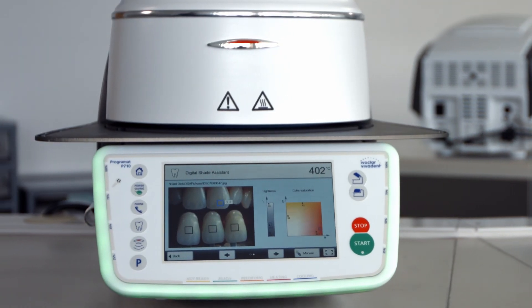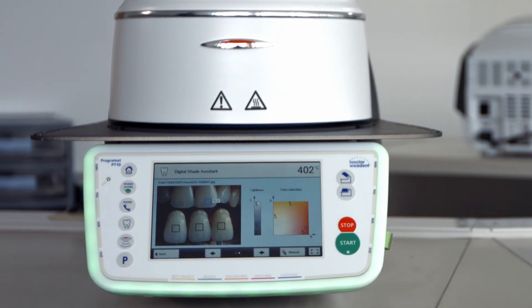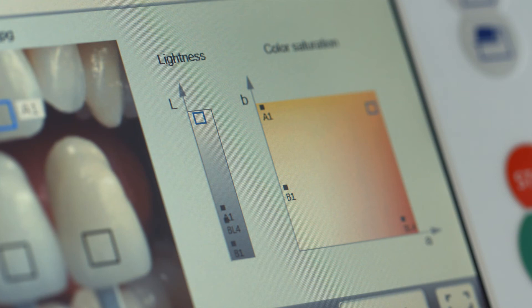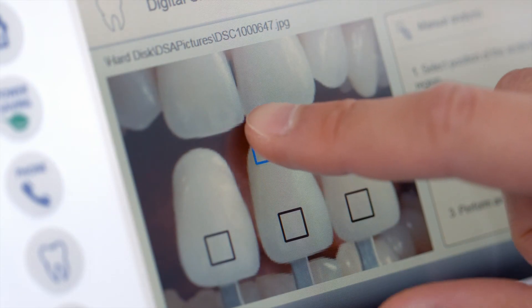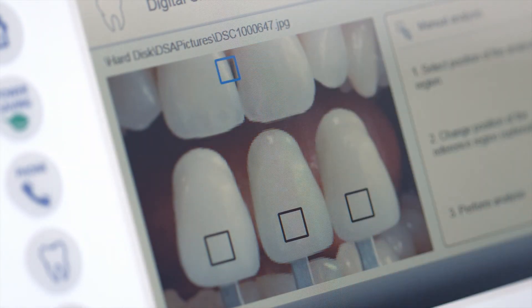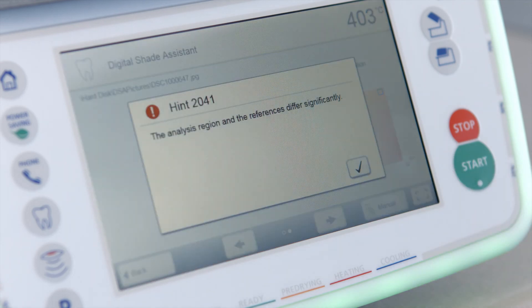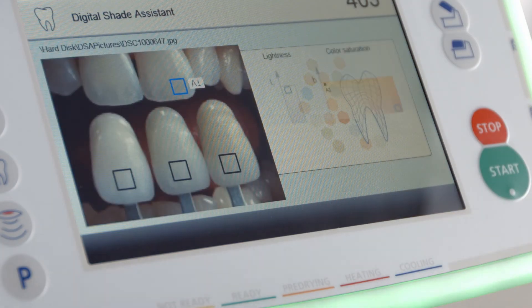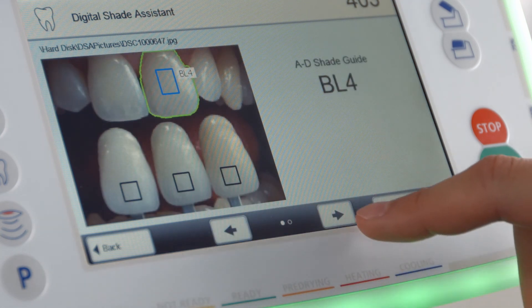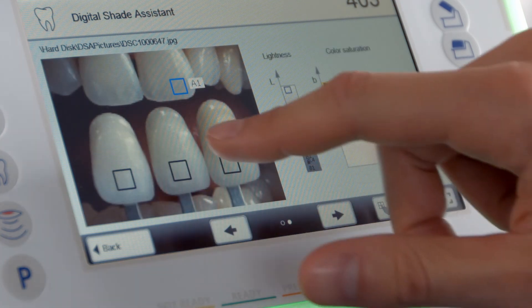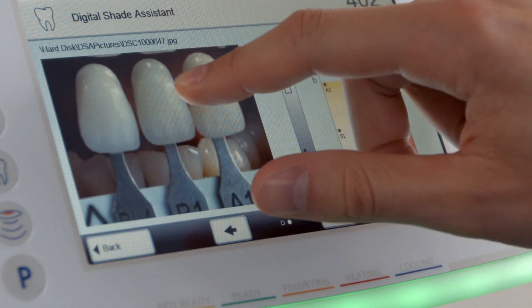The right panel of the display shows two diagrams. The diagram on the left shows the brightness of the three reference teeth and the tooth being analyzed. The diagram on the right shows the color saturation of the three reference teeth and the tooth being analyzed. An error message will be displayed if the difference between the patient's tooth and the reference teeth is too large. You can analyze any area as many times as you wish. Use the arrow keys to toggle between the automatic analysis and the manual analysis last performed.